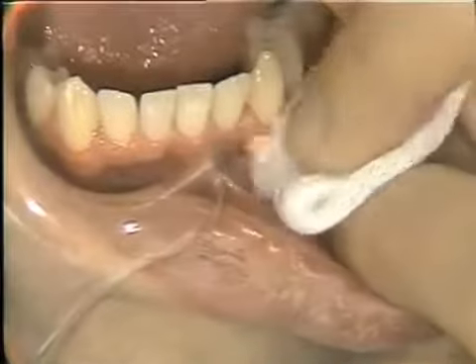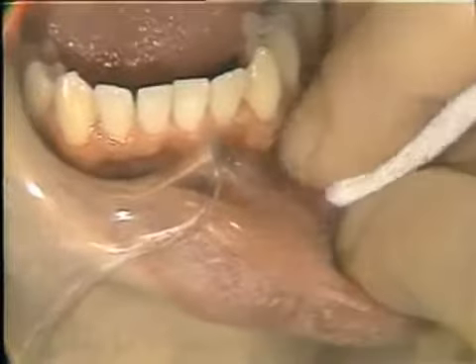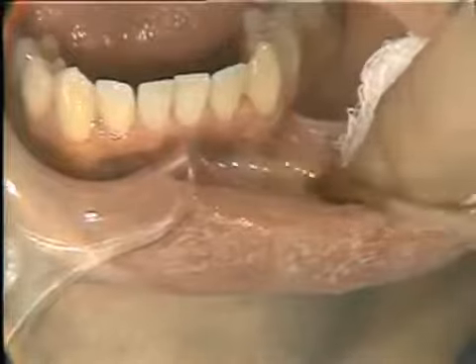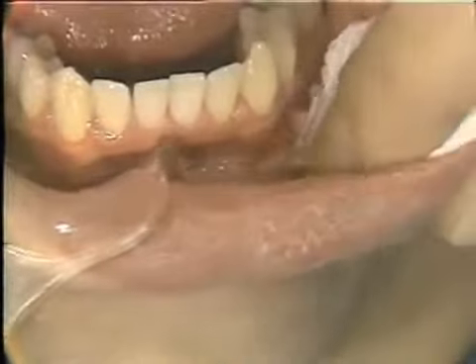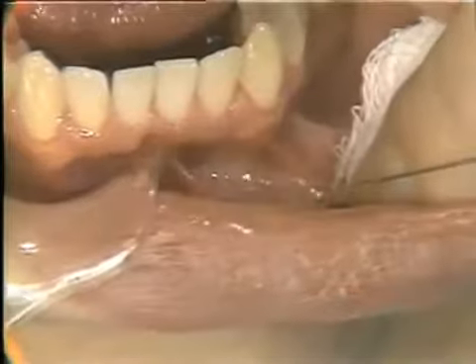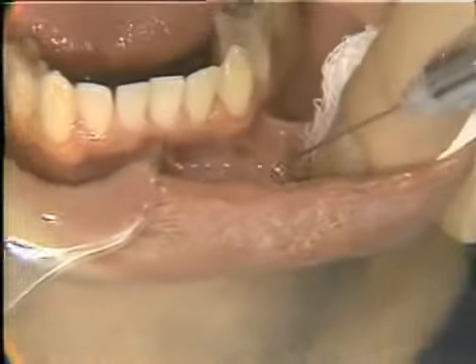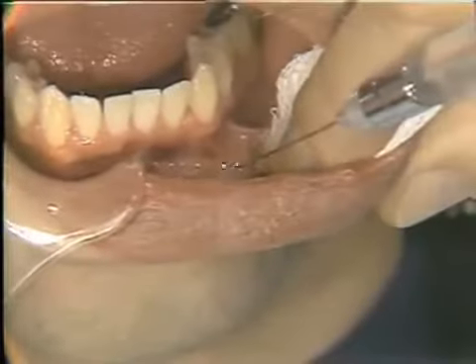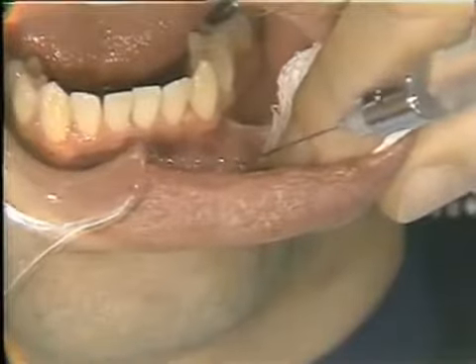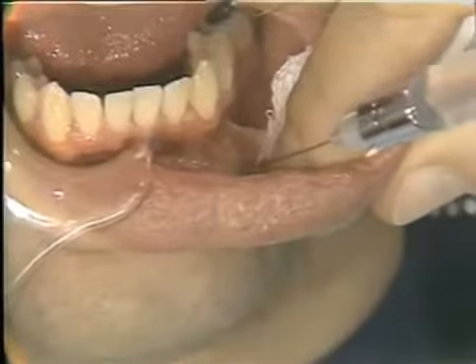I'm going to dry the mucosa again in the conventional way, just laying my gauze pad there for a few moments. And then we'll apply a little betadine to our injection site. Needle puncture out in the vestibule at about this angle, and then carried right through to bone at a level of or below the apex of the cuspid tooth. And remember again, it's a little longer than the other incisors. All right, this we have accomplished.